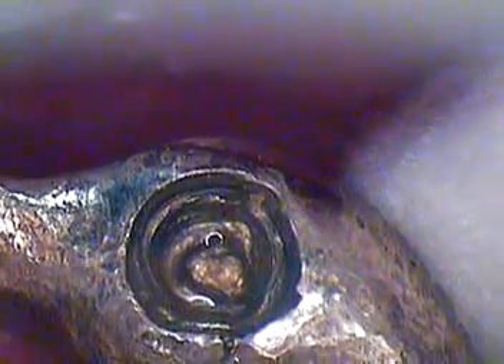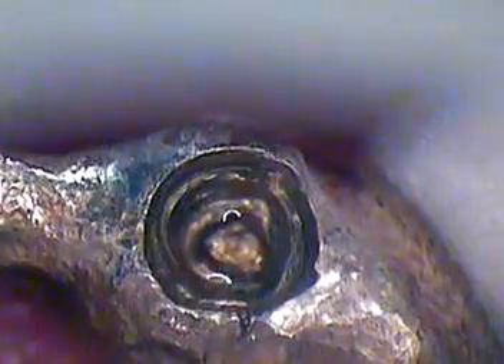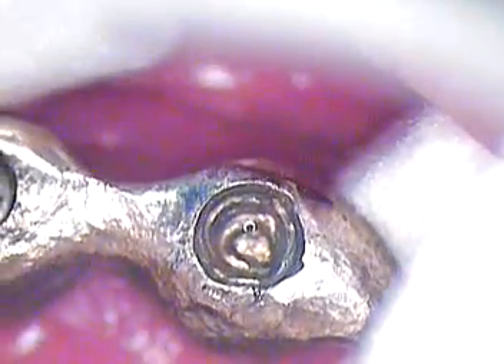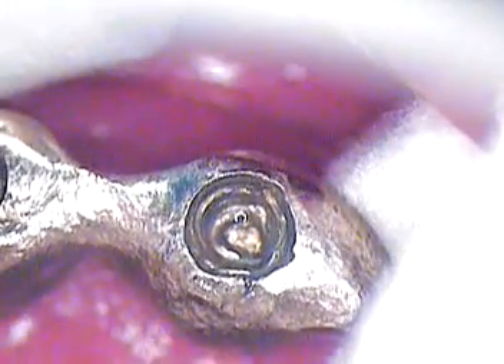The key now is, A, to see if we can dissolve some of the bio-burden that's caught possibly in and around the screw head itself, and B, remove the top of the screw head completely so that we gain access to the threaded portion of the screw. We have with us our representative Robert Marrero of Strahmann, who's going to give us a few coaching tips to make this job a little easier.